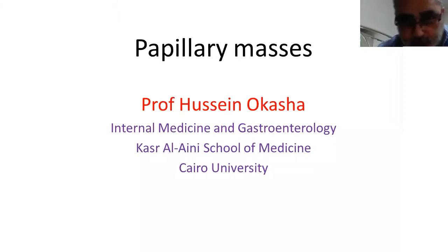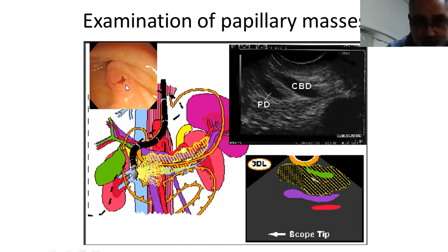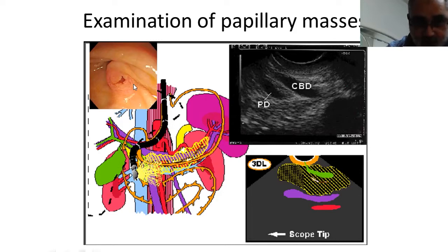Welcome to you all. In this short video, we'll discuss the papilla and papillary masses. To examine the papilla, we place the tip of the echoendoscope at the level of the papilla with a slight minimal upward deflection to kiss the papilla. Minimal clockwise rotation will delineate the papilla while inside the lumen, while slow gentle counterclockwise rotation will demonstrate the papillary region and the muscularis propria. More counterclockwise, we will visualize the common bile duct, pancreatic duct, and double duct sign.